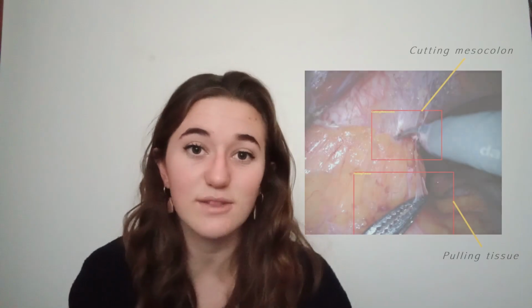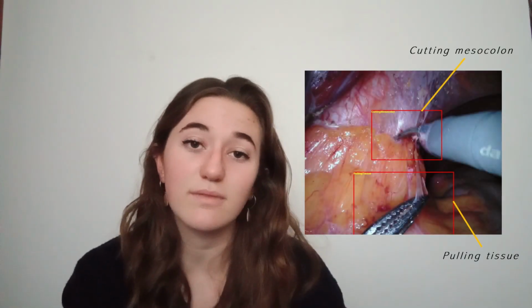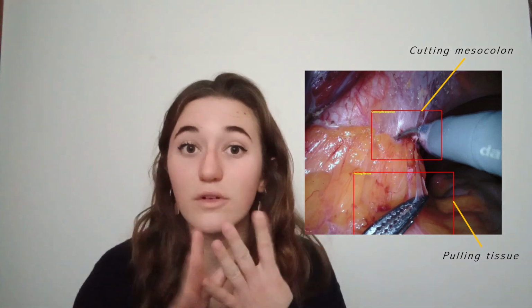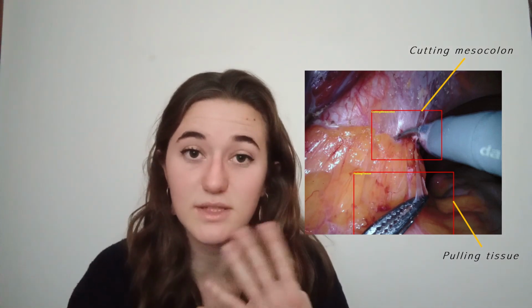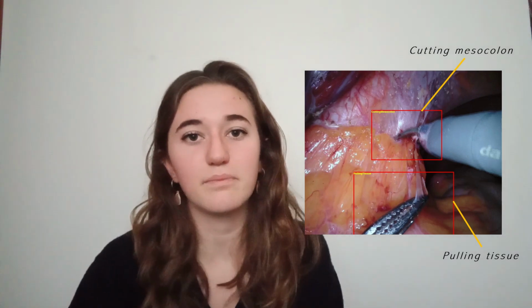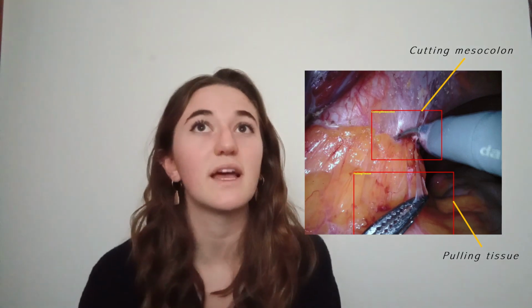And the endoscopic part is because all the material in the dataset is recorded with an endoscope that has a camera attached to it. The best way to understand this challenge is to look at the dataset that is formed by thousands of these types of images, and altogether they form 4 complete prostatectomy surgeries. A prostatectomy is removing the prostate from male patients.